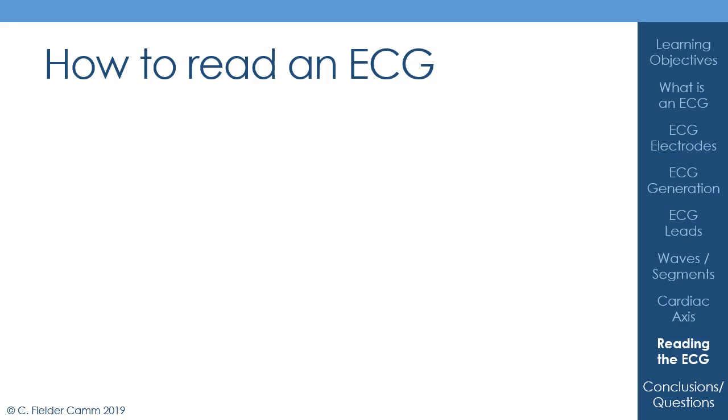So, how to actually read an ECG? I'm hopefully going to persuade you over the next few slides that taking a very systematic approach to the ECG is the key to ECG interpretation. Now, as you get more experienced and you see more and more ECGs, much of ECG interpretation will become pattern recognition. But I think it's very important to have a planned route through interpreting the ECG to fall back on for when that pattern recognition fails.